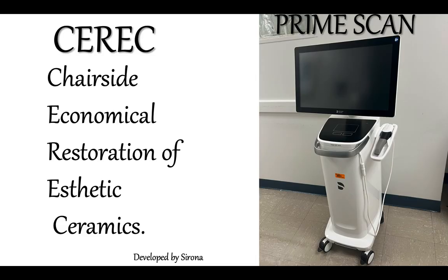The one that we have right now is the new version of that, but in the past, CEREC is the actual system, and it was developed by Sirona, nowadays known as Dentsply Sirona. CEREC stands for Chairside Economical Restoration of Aesthetic Ceramics.